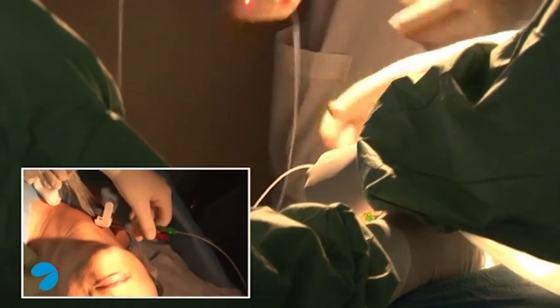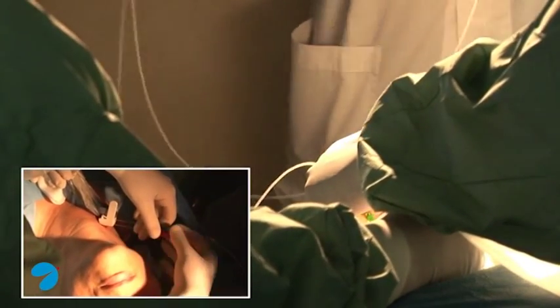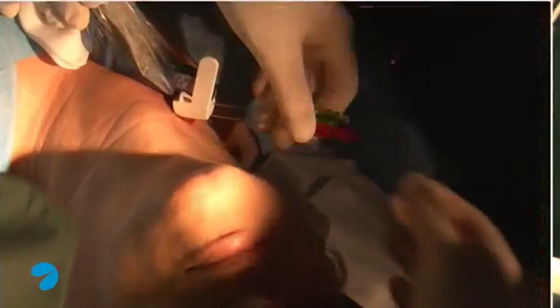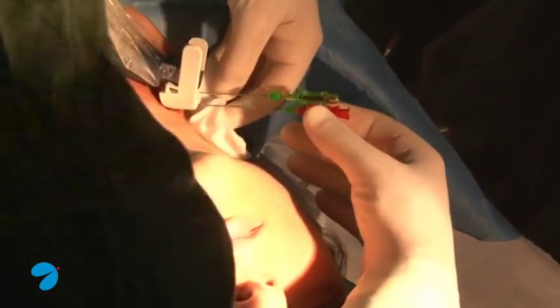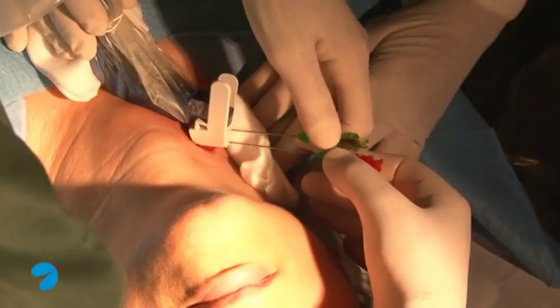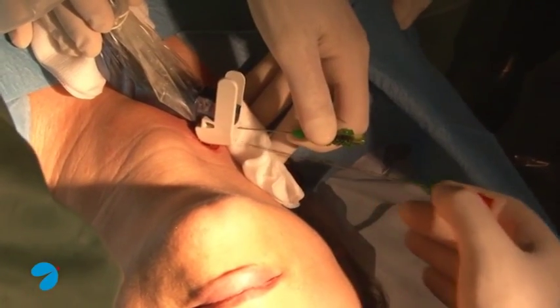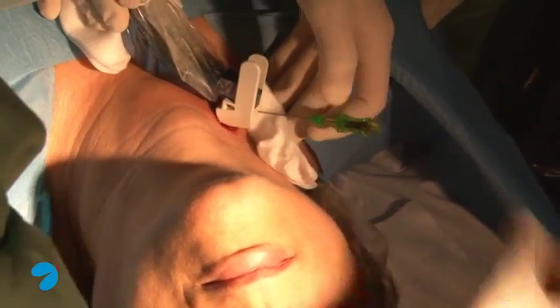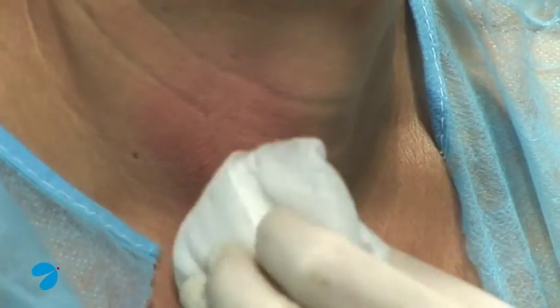We take out the fibers and remove the needles. We apply soft pressure to the patient's neck. We can observe the absence of scars due to the treatment.